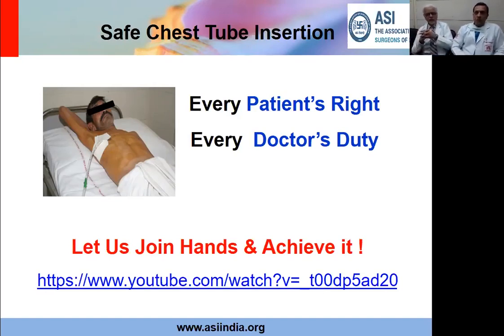Regarding removal after the lung has expanded, you mentioned that if the lung has expanded, even if the fluid in the chest tube is in the range of 100 to 200 cc, and it is clear fluid, this is the time you can take out the tube, and the patient is getting better. What happens to the column in this situation? Would the column keep on moving? There has been some misconception that, sir, the column has stopped moving, can we take it out? Is it something that will happen, or will the column keep moving as long as the tube is there?